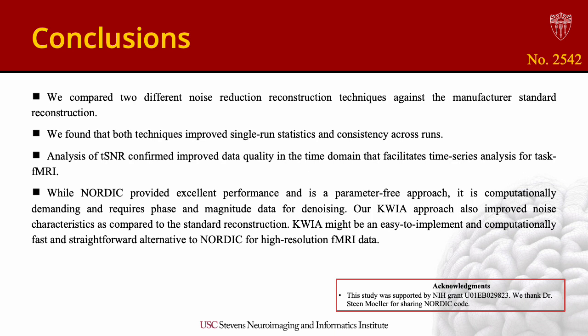In conclusion, we compared two different noise reduction reconstruction techniques against the manufacturer standard reconstruction. We found that both techniques improved single-run statistics and consistency across runs. Analysis of TSNR confirmed improved data quality in the time domain that facilitates time series analysis for task fMRI.